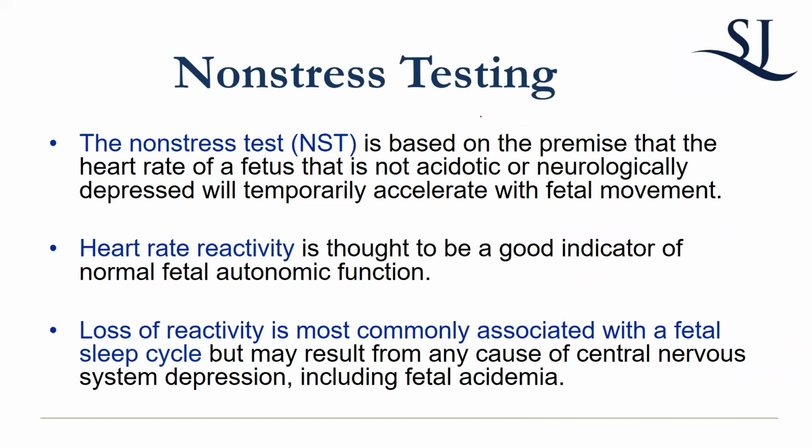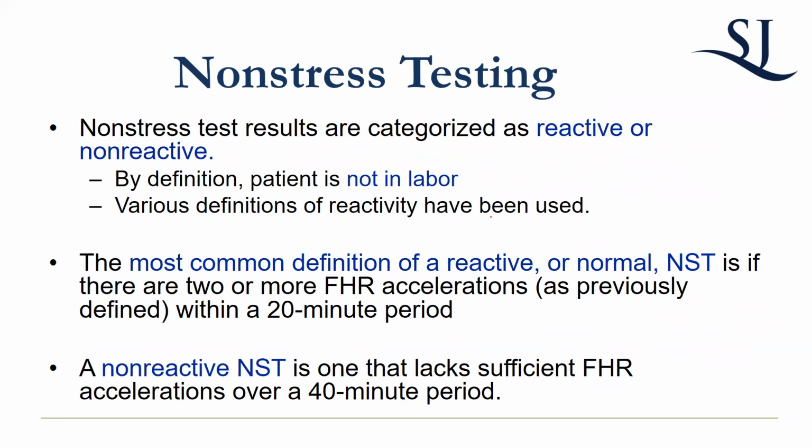So I'll just mention briefly non-stress testing. I've kind of spoken about it before, but this is, again, an assessment of the fetal status, but in the context of a patient who's not in labor, okay? And it's defined not in categories, but reactive or non-reactive. Reactive being what you want, non-reactive being non-reassuring. Just remember, not in labor, okay? So this is a little different because you need 2 or more accels, okay? This is why you need it. And it's in a 20-minute period. I kept saying it's over a 10-minute period. This is a 20-minute period.